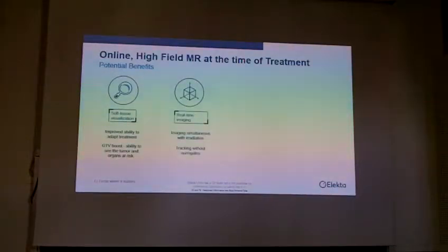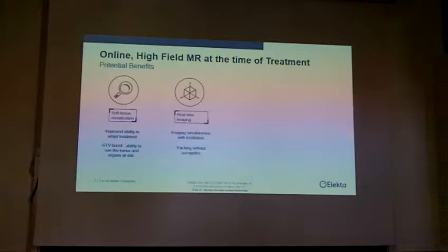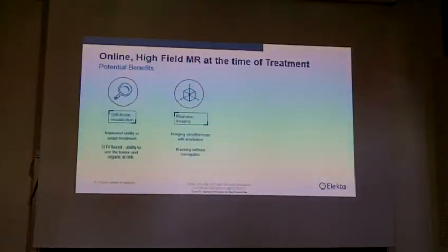What are the potential benefits of online high-field MRI? First, soft tissue visualization, with improved ability to adapt your treatment. Secondly, the ability to see the tumor and the organs at risk, with real-time imaging during irradiation and tracking without surrogates.